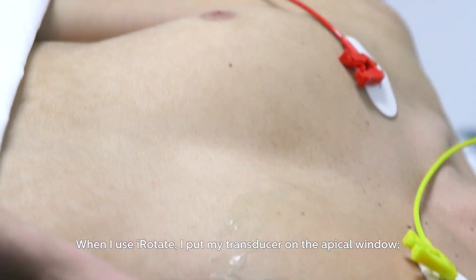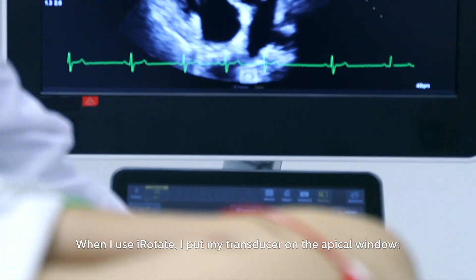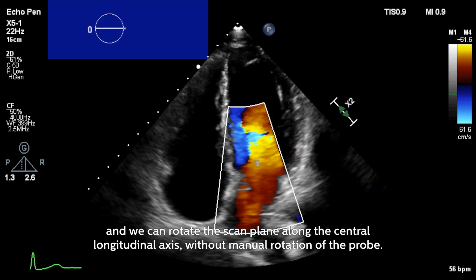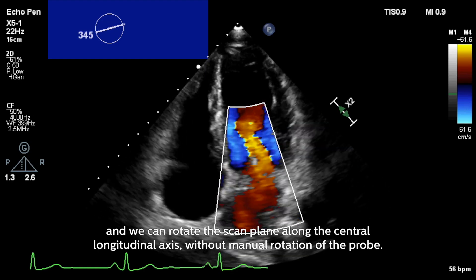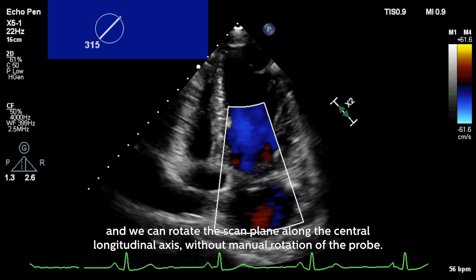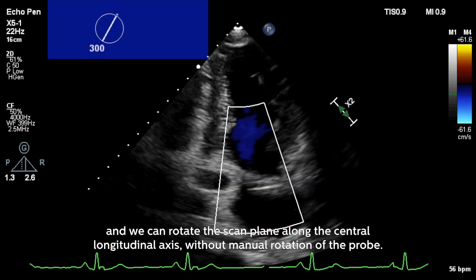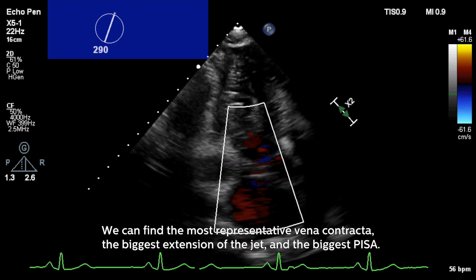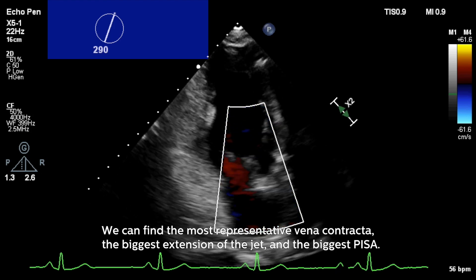I put my transducer on the apical window, and we can rotate the scan plane along the central longitudinal axis without manual rotation of the probe. And we can find the most representative vena contracta, the biggest extension of the jet.